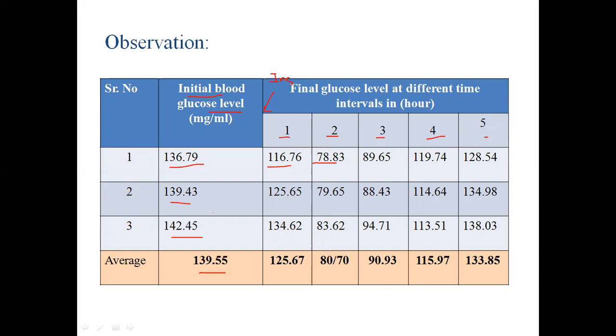For the second animal also, see the same response. The minimum blood glucose level is at 2 hours, and after that there will be an increase.